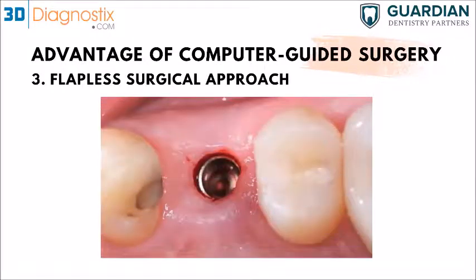And then, of course, one of the most important advantages as well is to have an easy flapless surgical approach. It's easier for you, easier for the patient, always better for the healing as well. So guided surgery can help you with that. And again, one of the most important things when we plan for a flapless procedure is it depends on the position of the implant you're placing.